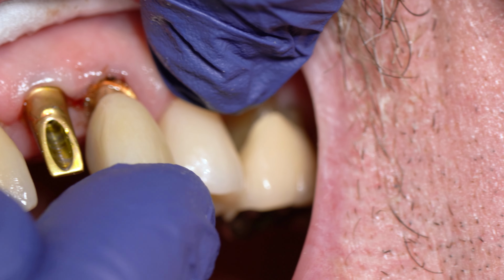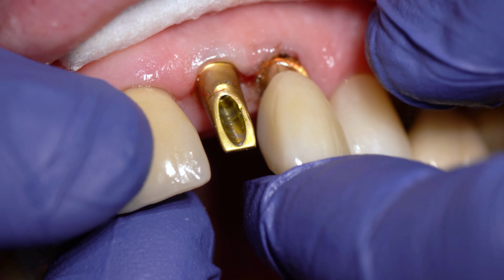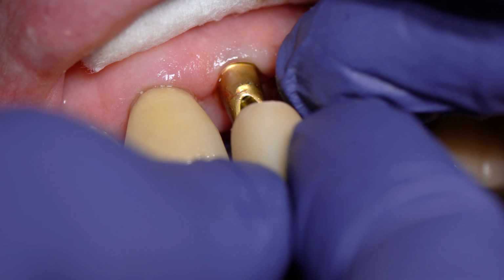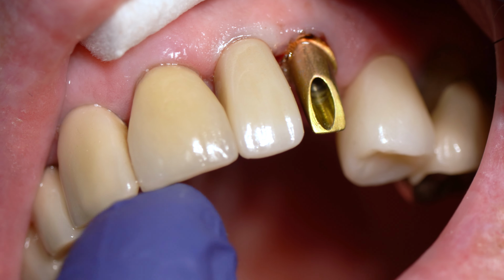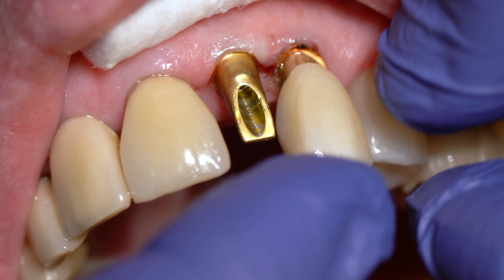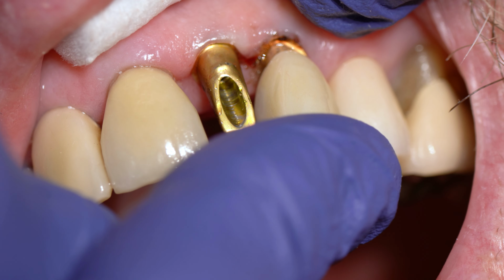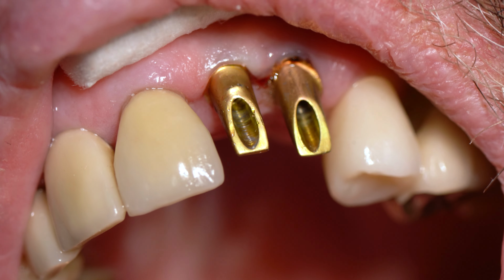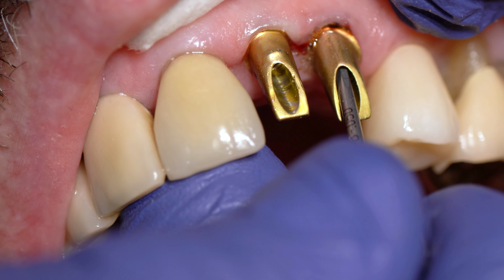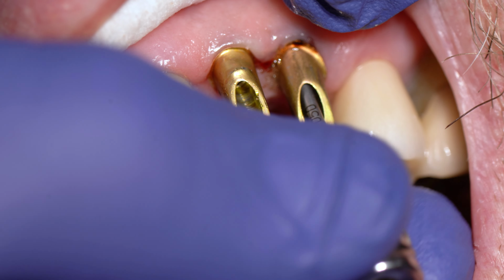So it means something is wrong, right? Something is wrong with this situation. Either the crown is over-contoured or the abutment is not placed properly. And so you can try a couple of things. You definitely want to remove the adjacent one, see if it's a contact issue, see if there's a contour on the crown that's inappropriate. But if that's not it, then the other thing that you want to check is your model. So it might be that something is wrong with your model, which means something was wrong with your impression.